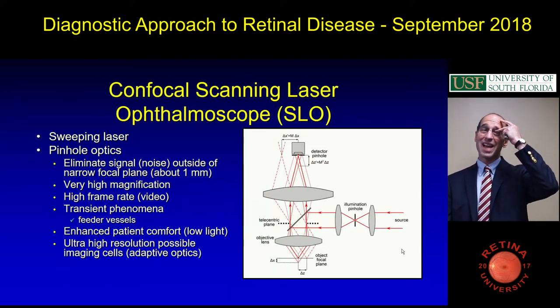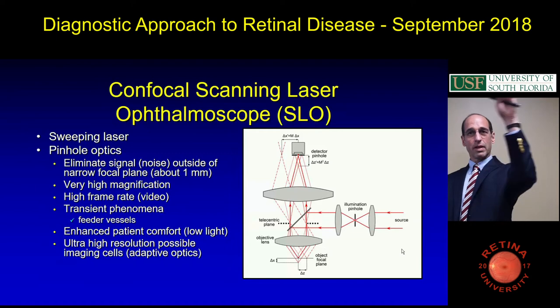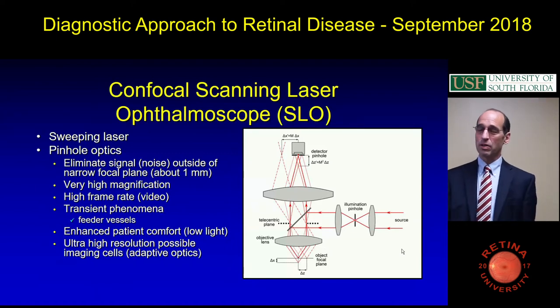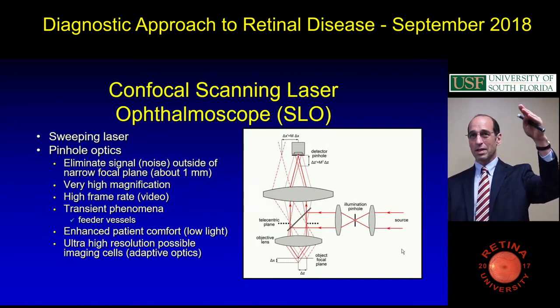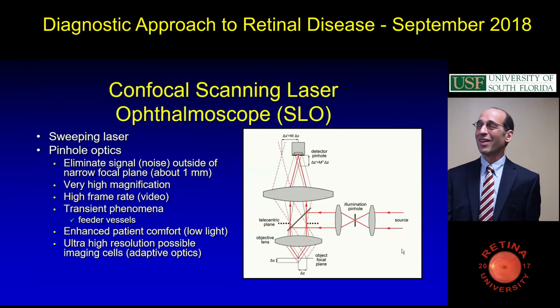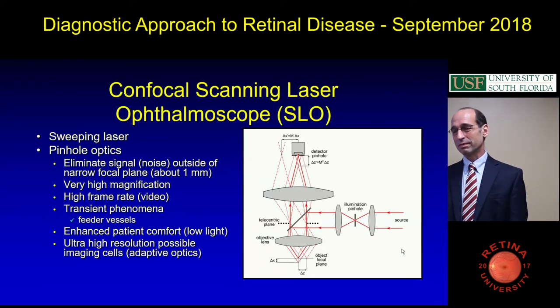Right. And I have to say, my routine is starting at 12, and I go around temporal and come around this way on everybody. That's just the way I do it. I don't know that it's not better to start going around the other way so you get the worst part out of the way first. Yeah, it's better to get them prepped. That's what I think. That way they're used to the depression when you get to the worst part, which is supranasal.